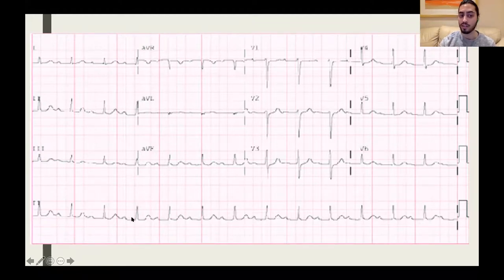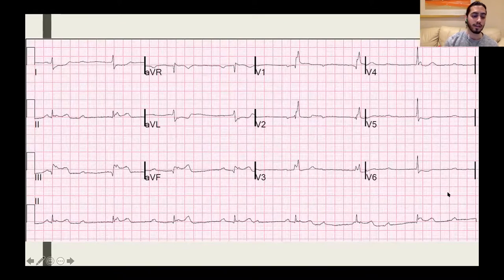You have a lengthened PR interval, constantly lengthened. No dropped beats. Okay, so this person has first degree heart block, probably a normal variant. If not, then you just monitor and wait. Nothing too exciting. Diagnosis here. We've just got three more.